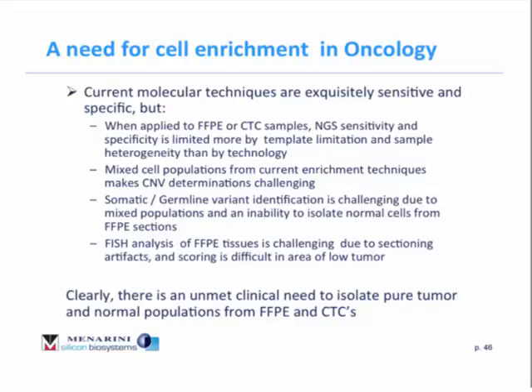Clinical samples, we get all types. We get fine needle aspirates, we get large blocks with large proportions of tumor, we get old slides with small percentages of tumor, we get CTCs from three or four different purification technologies, and we're expected to be able to perform high quality analysis from all of these templates.